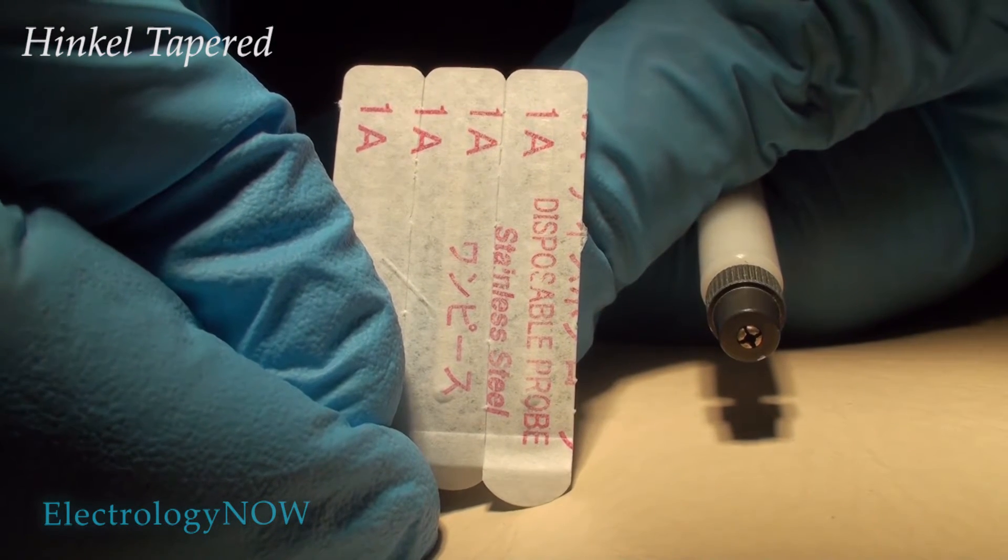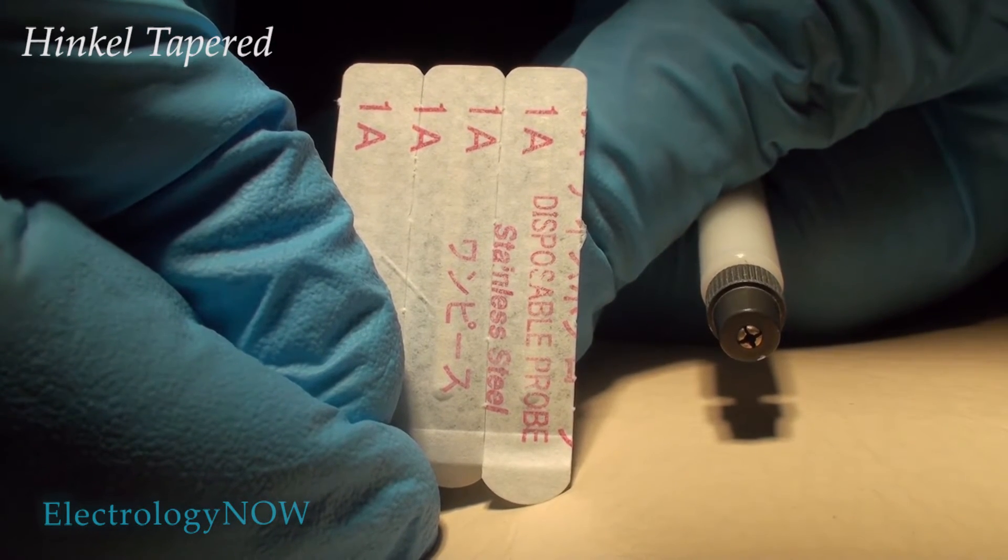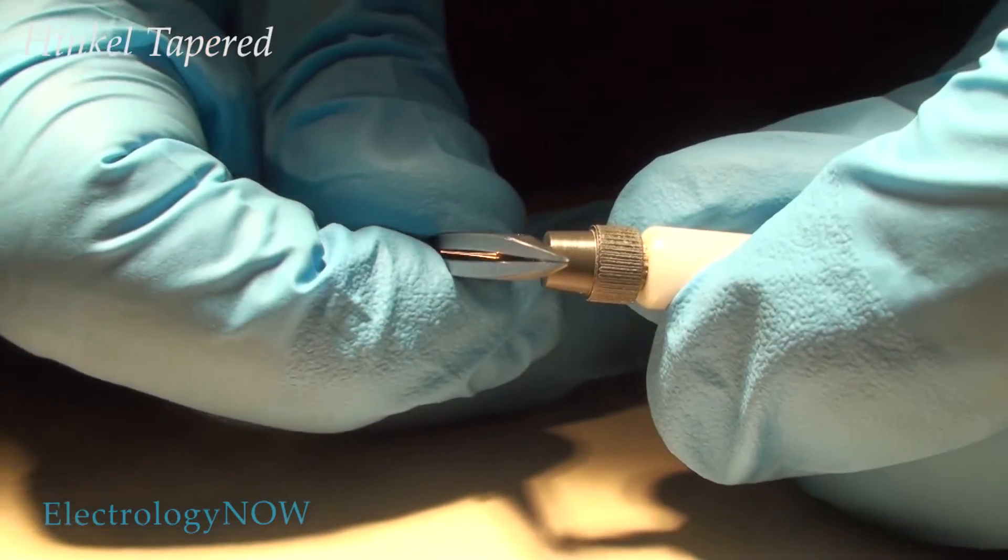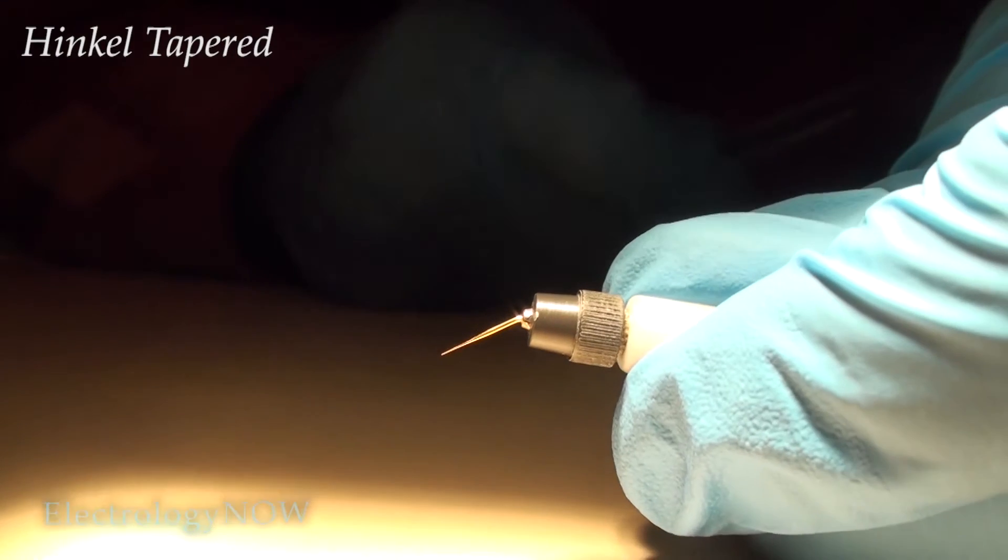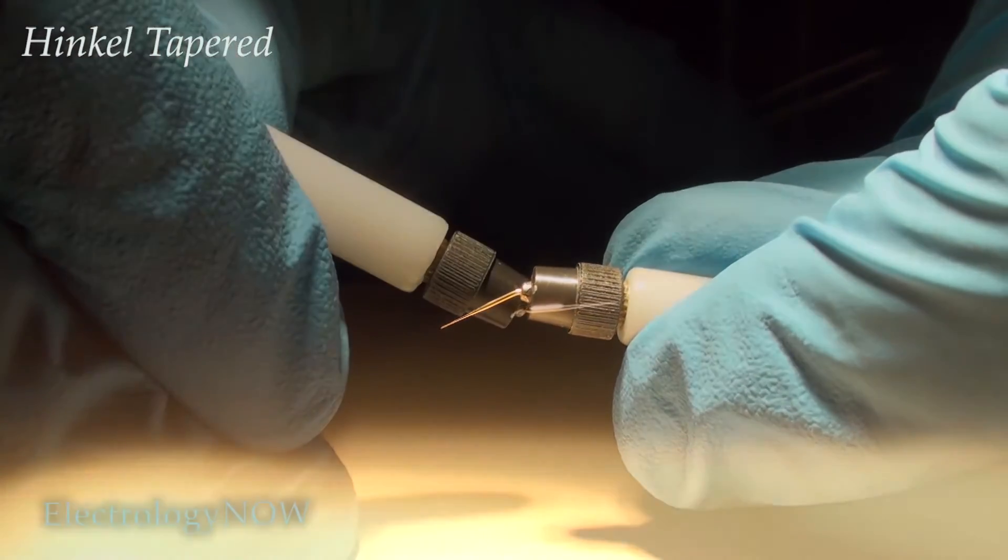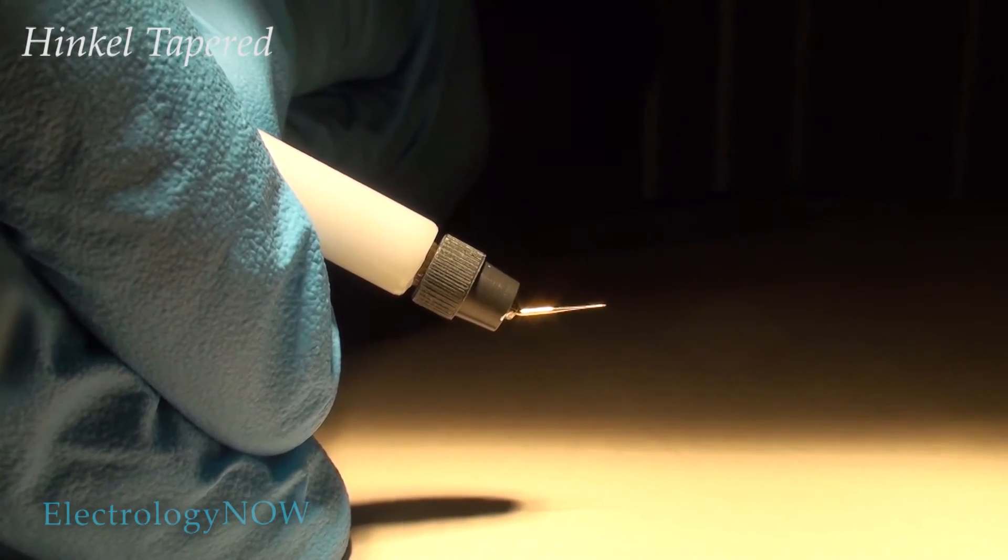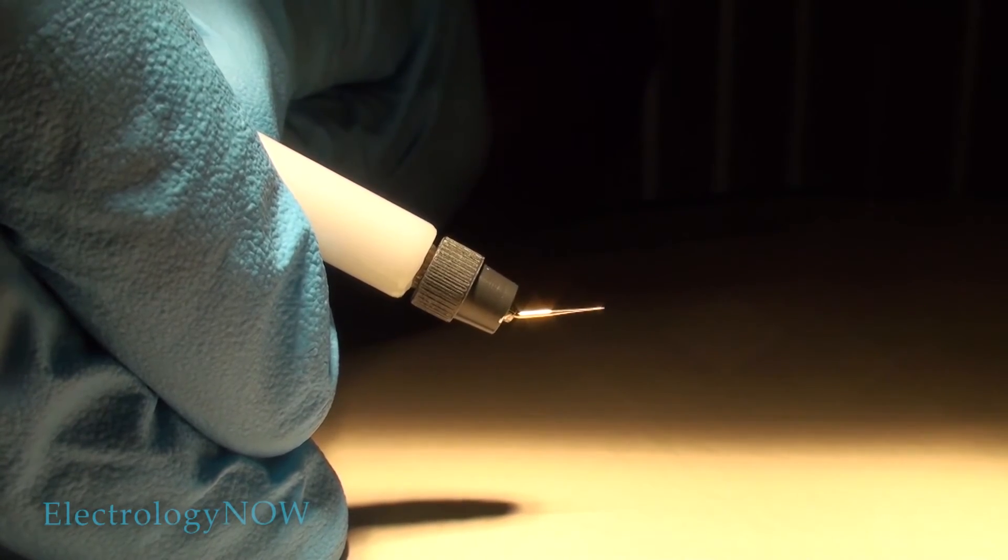These are needles that were made in Japan for the Hinko Company. They're tapered needles and they're very nice. These needles bent very easily and they were gold-plated. This is the Hinko gold-plated tapered needle. They're no longer available.